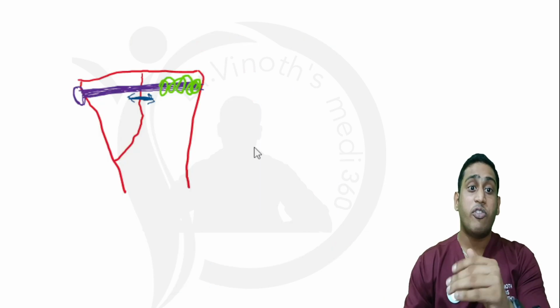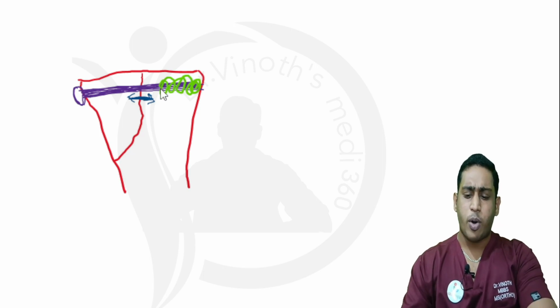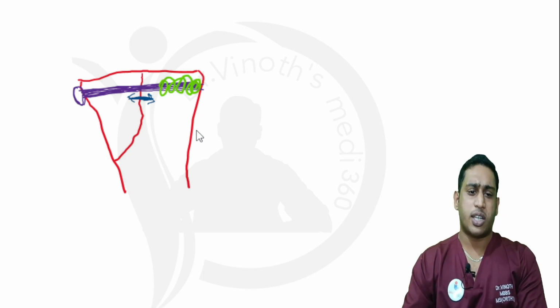If I want to use a cancellous screw separately, then I will be using a partially threaded cancellous screw. What is meant by a partially threaded cancellous screw? As you can see here, the threads are present only in the distal aspect, not at the proximal aspect. On the other hand, this is a fully threaded cancellous screw. So what is the purpose of this partially threaded cancellous screw?